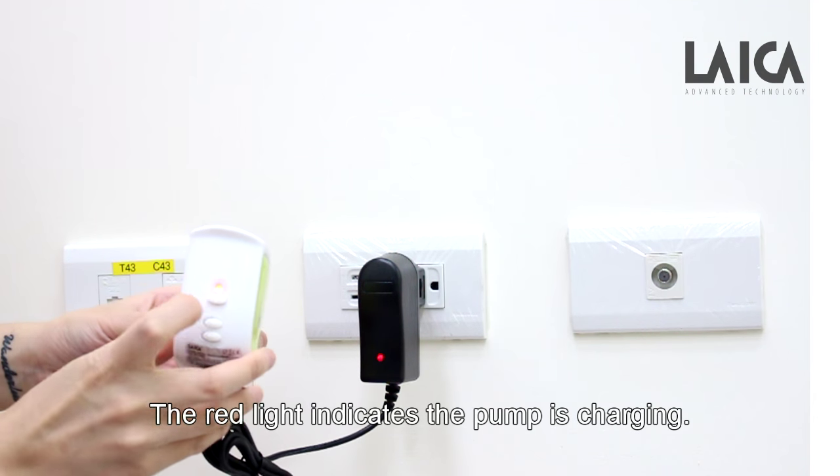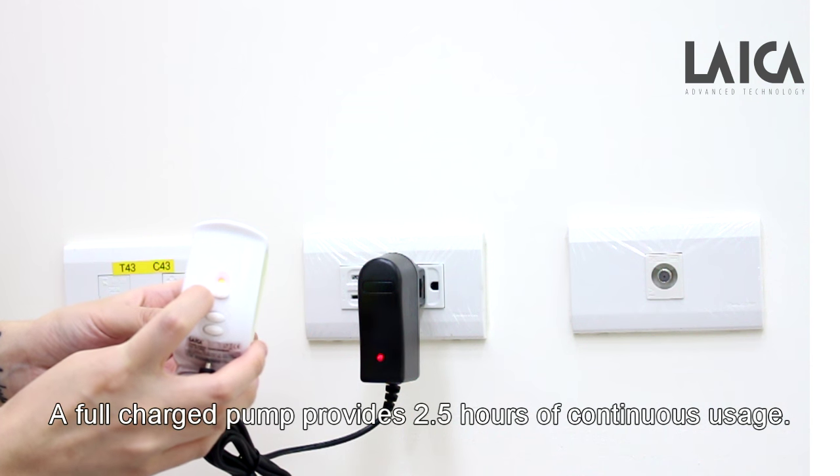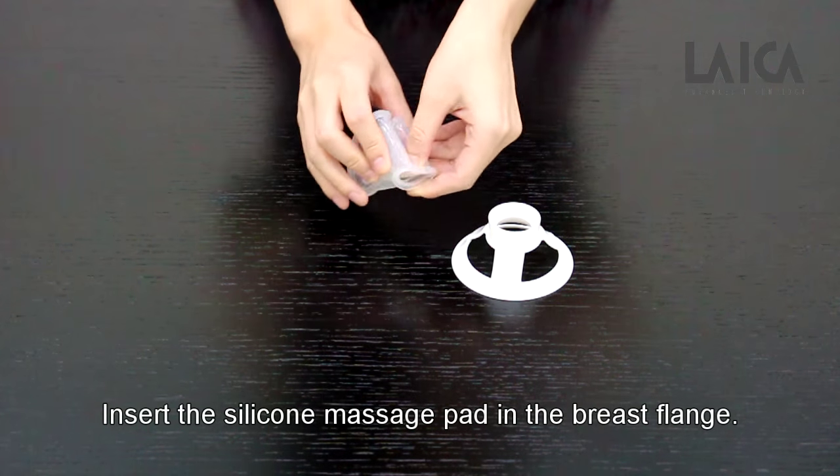The red light indicates the pump is charging. A full charge provides 2.5 hours of continuous usage.